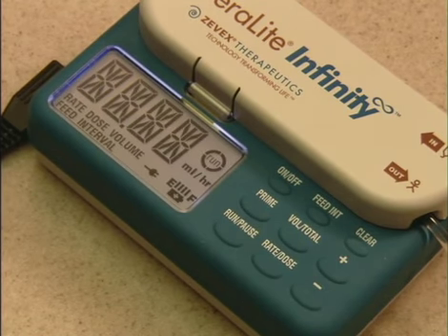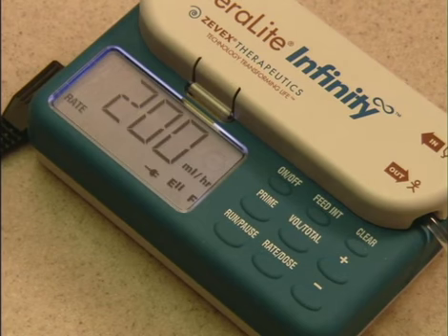You can charge the battery whether the pump is running or turned off. And you can see how much the battery is charged by unplugging the charger and turning on the pump.